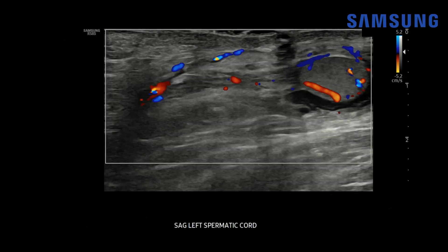It's important to evaluate the spermatic cord whenever there's a question of testicular torsion in a patient with scrotal pain, because you may see the whirlpool sign — a twisting or torsion knot of the spermatic cord — which is quite specific for torsion. But here we see a nice normal straight spermatic cord leading to a normal testis with vascular flow. So we've excluded active left testicular torsion.